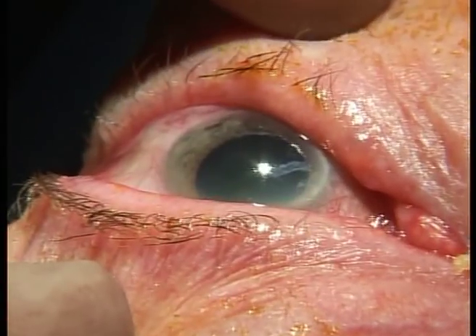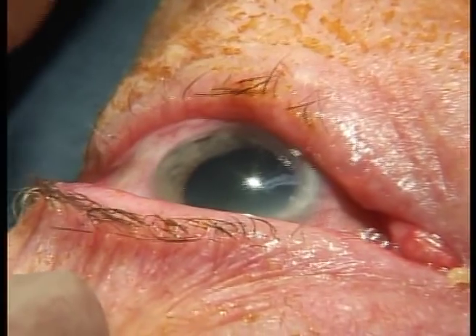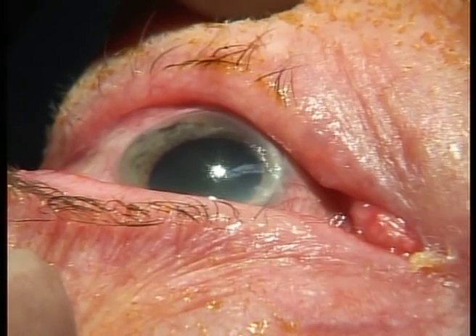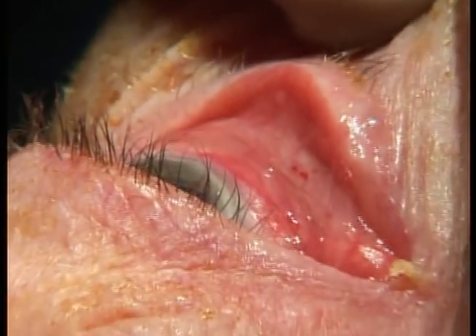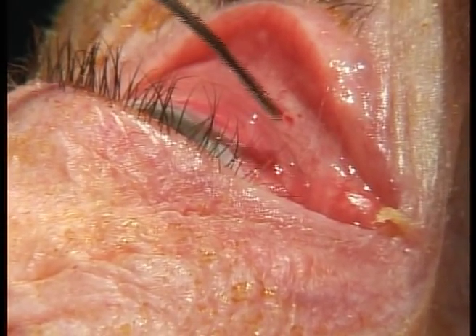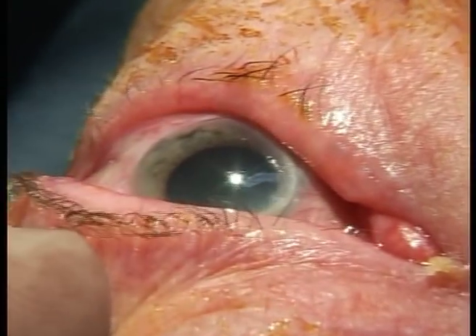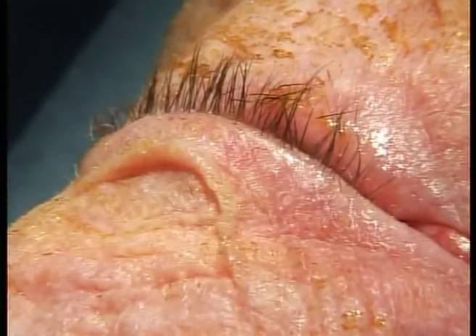If I can just point out the site of my incision is covered by the lower eyelid. I think a good cosmetic result is not the be-all end-all, but I think it is important, and we should try and make the eye look good afterwards. So if I pull down, you can see down about here is where I made my incision, and in fact it's a little bit covered by redundant layers of tissue here, but that all gets covered up completely when the eye returns to the neutral gaze, and so I don't end up with a red eye.